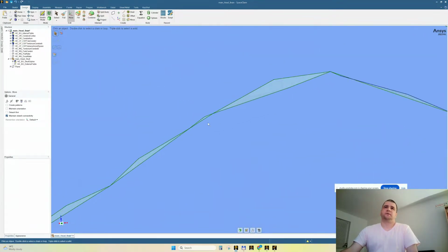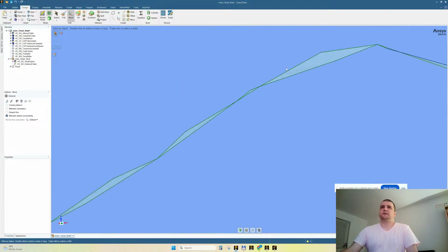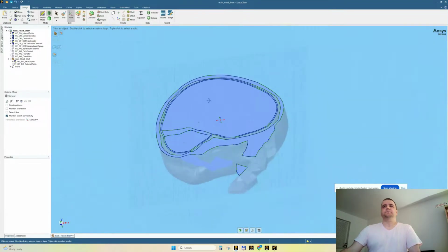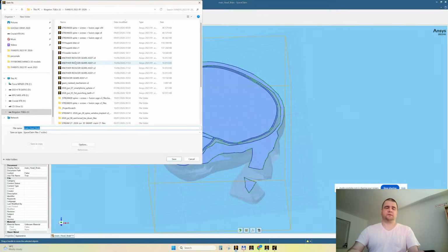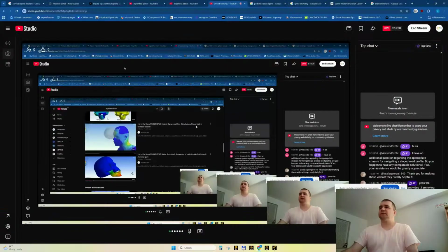Look here. All right, at least here it's the only interference. There are some gaps, but we do not have lots of interference. Only small interferences. Let me save this, because this is very important to me, at least. Where was I? Checking to see if there is. All right, we'll come back to some.